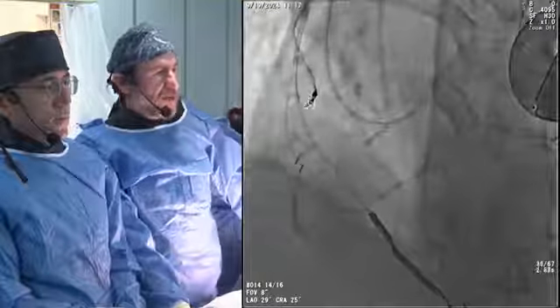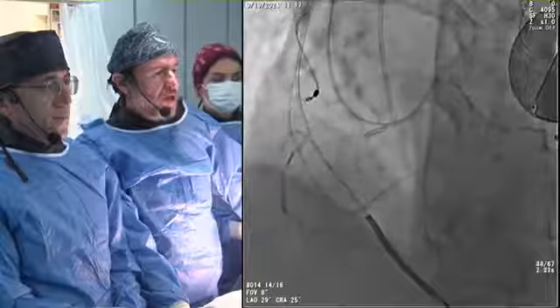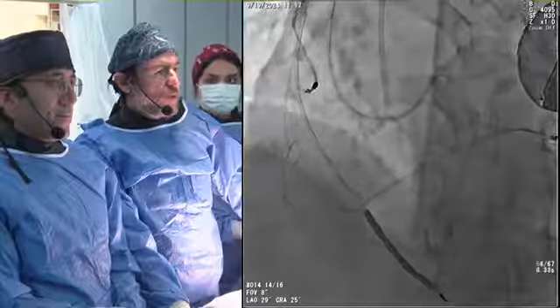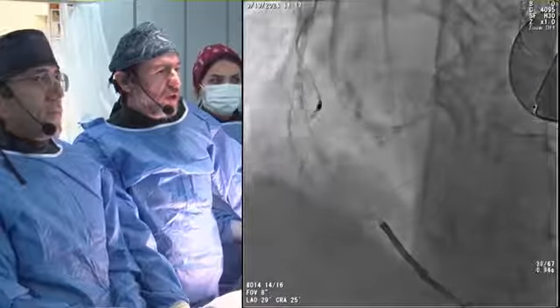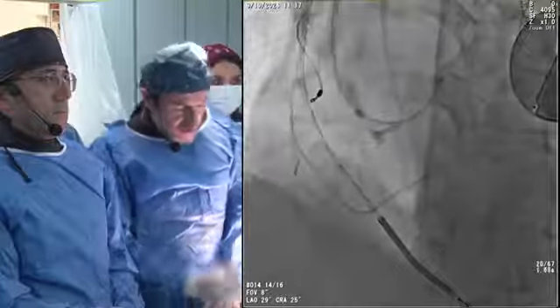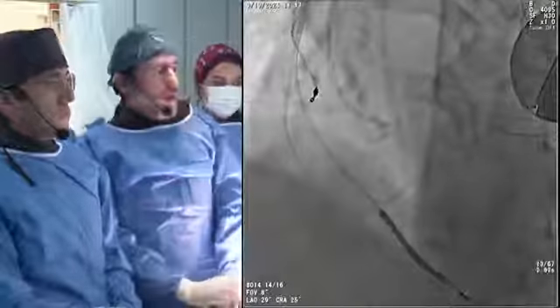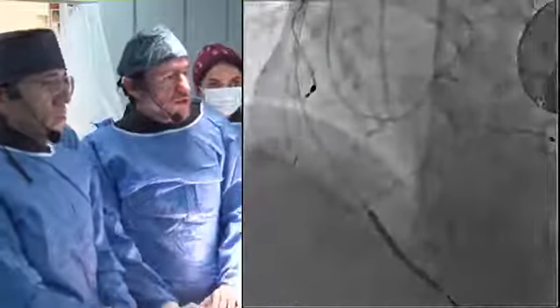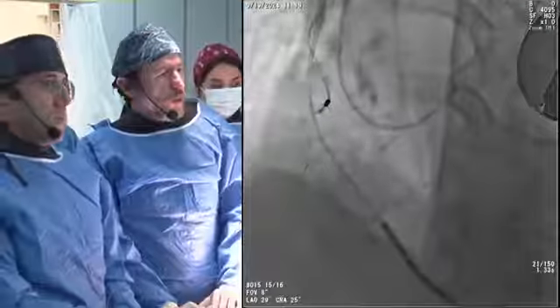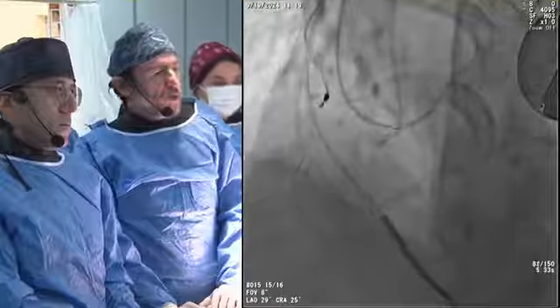So we have some calcification there, and we have a side branch coming out there, a right ventricular branch, and we have no engagement of the ostial RCA. So Bektaş, I need you and Masaya Sensei's advice. What should I do from now on? So next one, we punctured first with a 3 gram polymer jacketed wire.